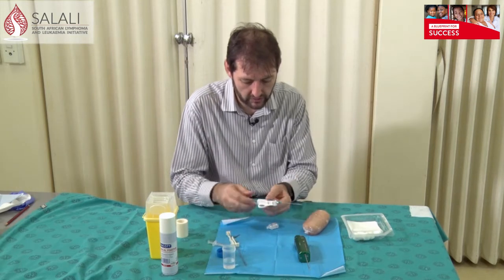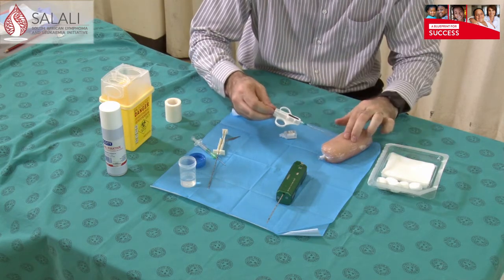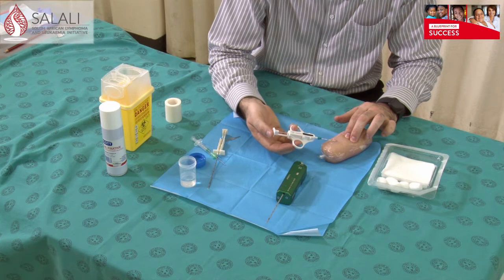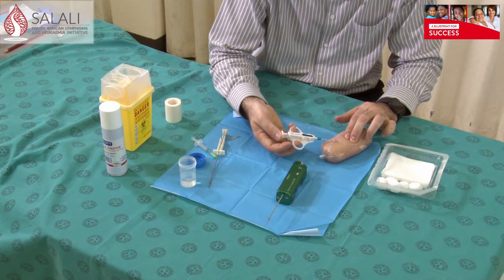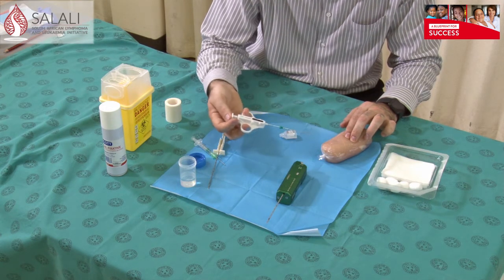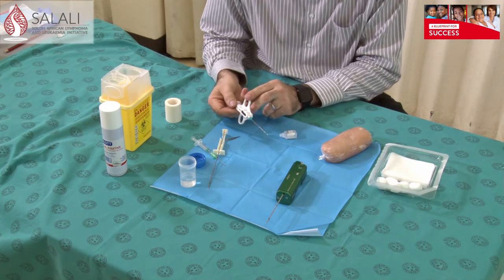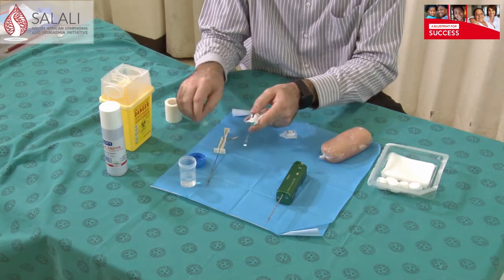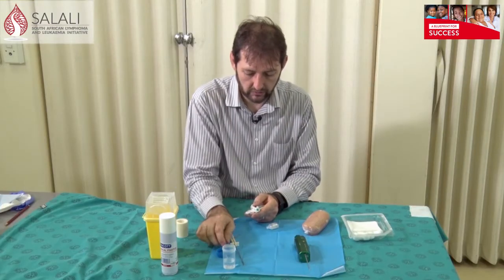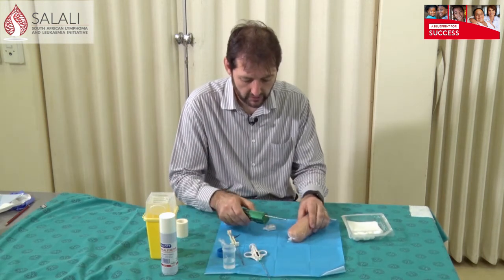The next needle I'll show you: this needle is activated, so pull it back to get it activated. Go through the skin into, or just in front of, what you want to biopsy. Push it forward and, once you're happy with the position, keep pushing it forward until it takes a biopsy. Then remove it, pull it back, open the channel, and inside will be your core biopsy. Again, take that specimen with a needle into your formalin, and don't put your biopsy needle into the formalin.